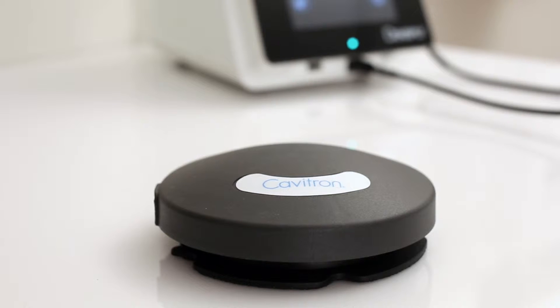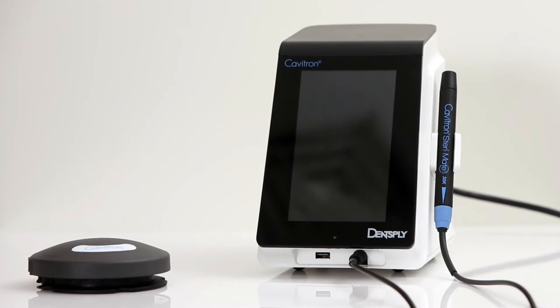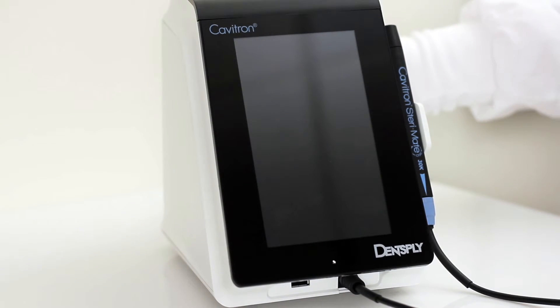Users should maintain a distance of no more than 10 feet between the base unit and tap-on foot pedal during the synchronization process. To synchronize the foot pedal, begin by turning on the main power switch located at the rear of the system to the on position.